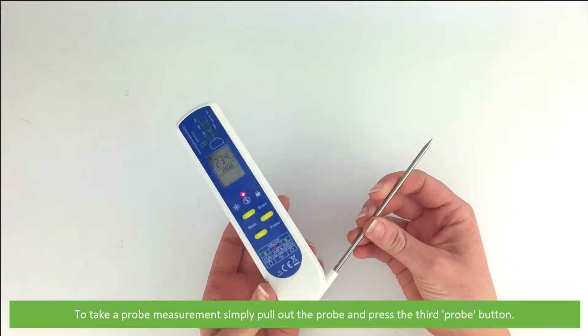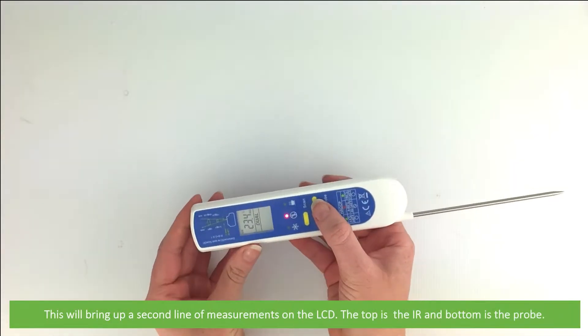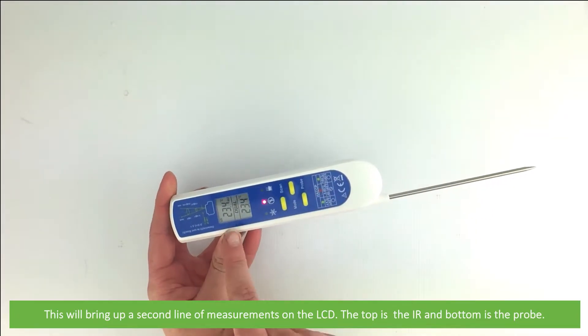To take a probe measurement, simply pull out the probe and press the third probe button. This will bring up a second line of measurement on the LCD screen. The top is the infrared and the bottom is the probe measurement.